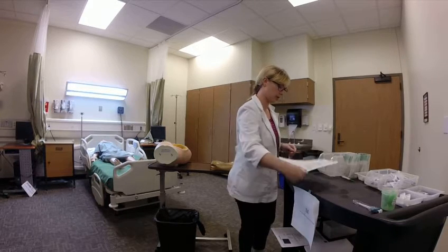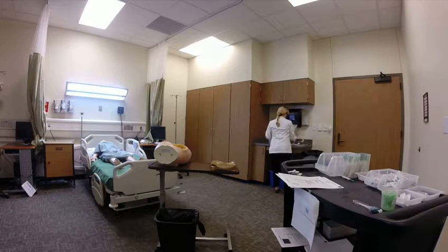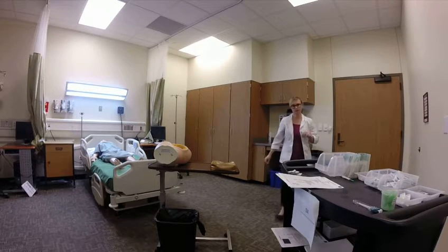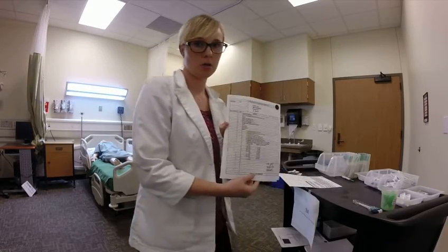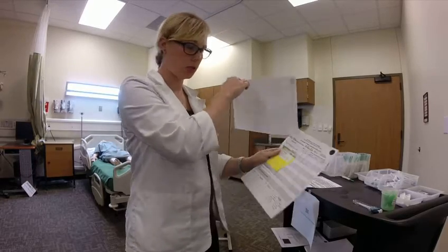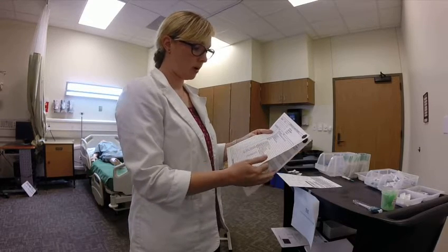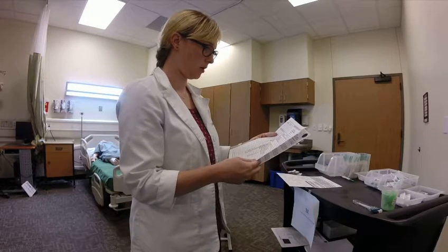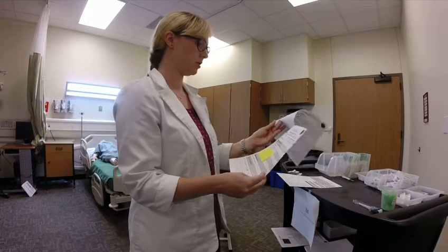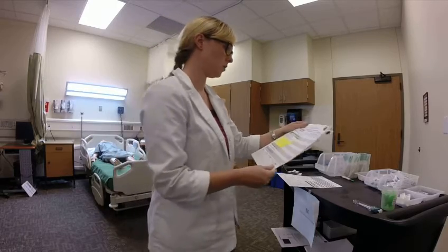First thing I'm going to do is wash my hands. All right, washed my hands. Now I'm going to verify my physician order to my MAR — I'm just verifying physician order to MAR. I have Rocephin 250 milligrams IM every 12 hours times two doses for I.M. Hurt, 88109530, for Dr. Brown, date of birth 1234, no known allergies. Look back here: Rocephin 250, all the information matches. Verified my physician order to my MAR.